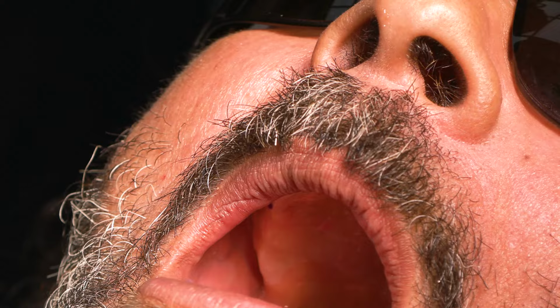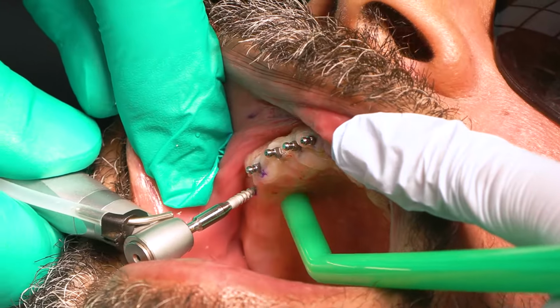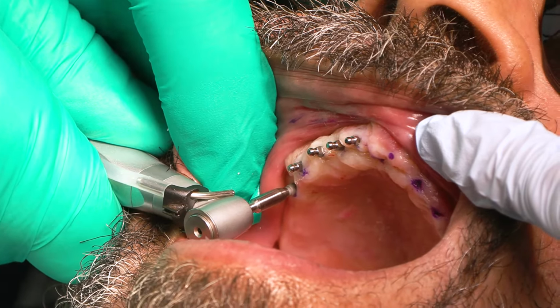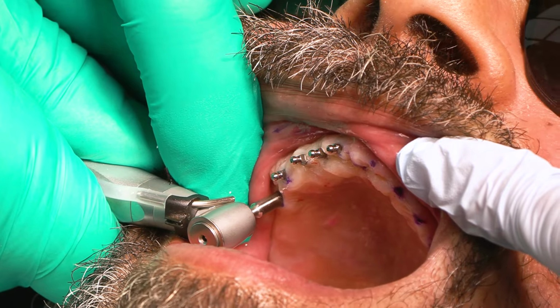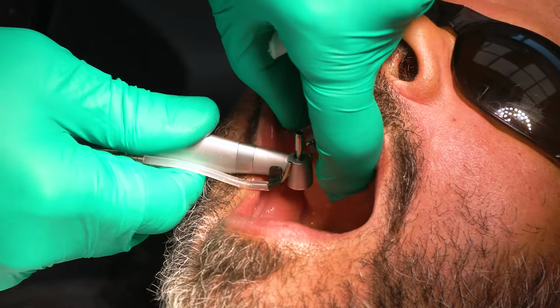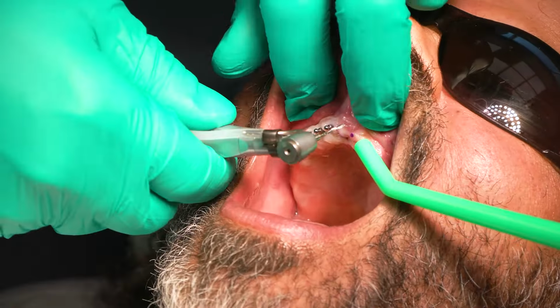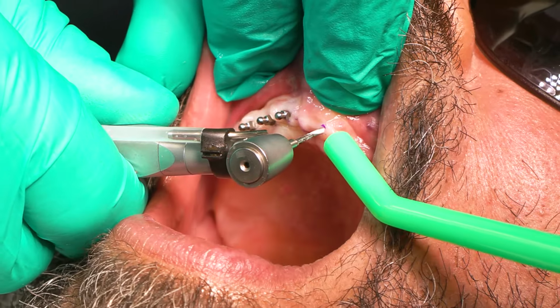Next one. This is a 10 millimeter, right? Yes, that is. All right, we're using the shorter one in the back because his sinus has come down. Okay, five implants in. Now we'll do the other side. And we're going to do a Zantex Allure restoration, I think, on the upper here, because he's got to have some lip fullness.